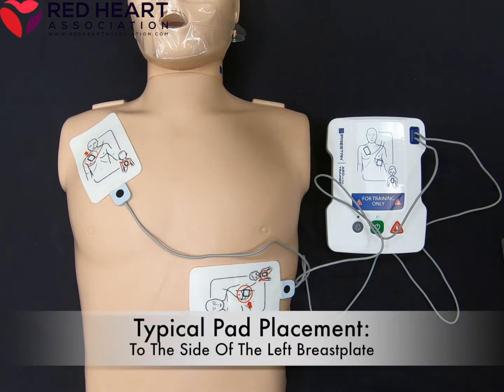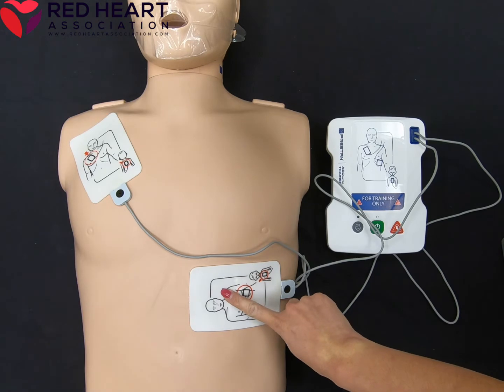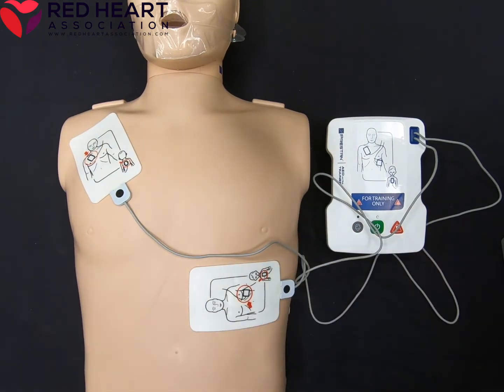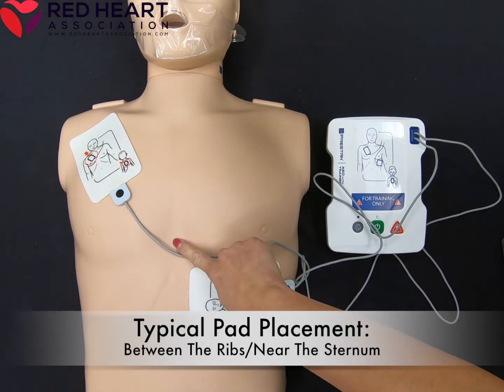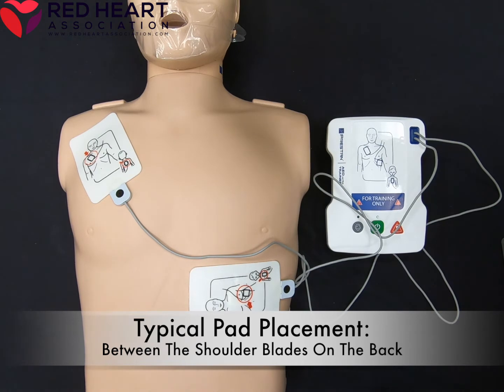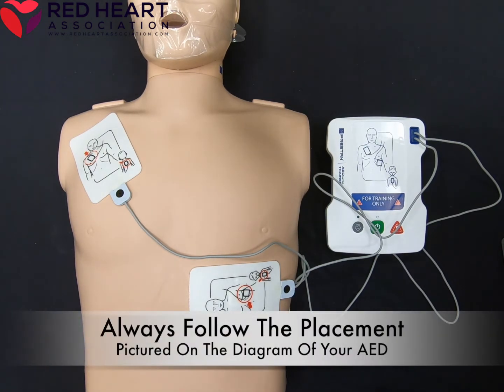The pads are usually placed to the side of the left breastplate and below the right collarbone, or placed between the ribs near the sternum and between the shoulder blades on the back. Always remember to follow the placement pictured on the diagram for the AED you're using.